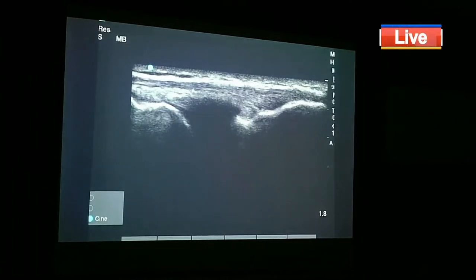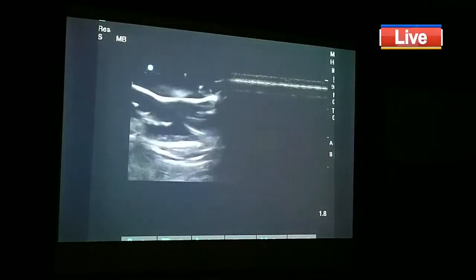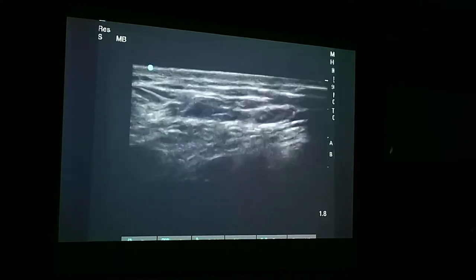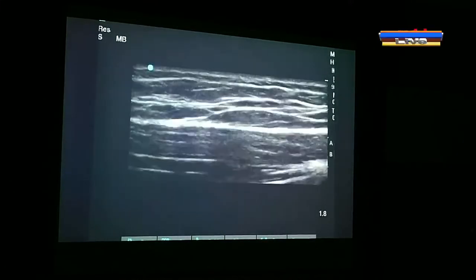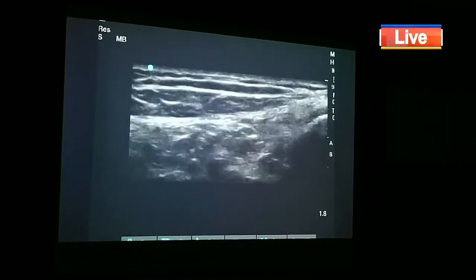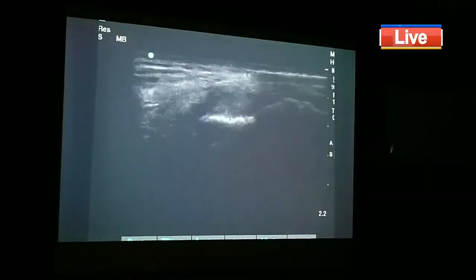Okay. Now once you go down, you'll see the fibular head. We are not going to the fibular head, and the area of our interest is the medial one. With this medial one, you will see this structure again, and you will see it very nicely, because we are going to do the genicular location also there. Now I'll show you the medial structure. Now the same thing comes up from top. In medial, the meniscus is slightly thicker. The height is slightly more. And I forgot to mention that you can measure it also.